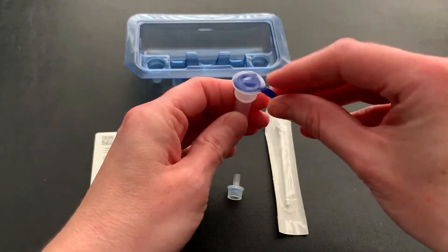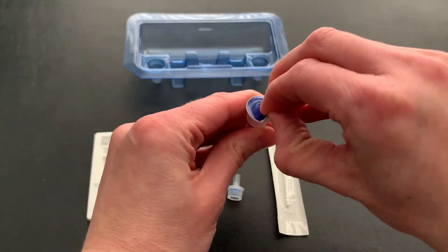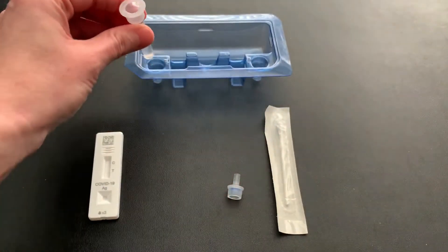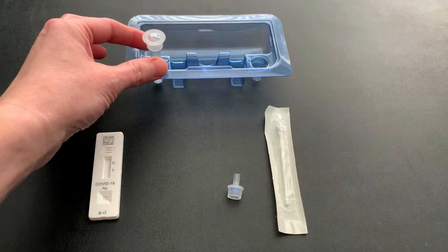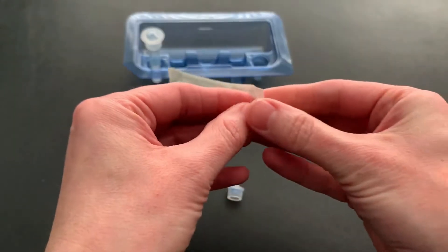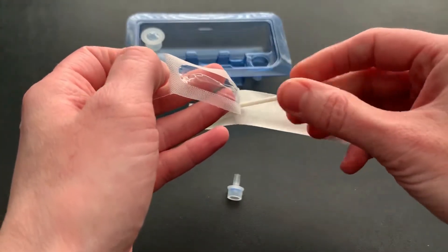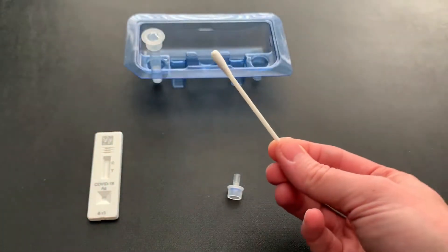Grab that extraction vial and gently peel off the aluminum foil seal. To make it easy, go ahead and place it right back into the packaging tray. Then take your nasal swab, remove it from the pouch very carefully — do not touch the swab tip, as that could potentially contaminate your results.